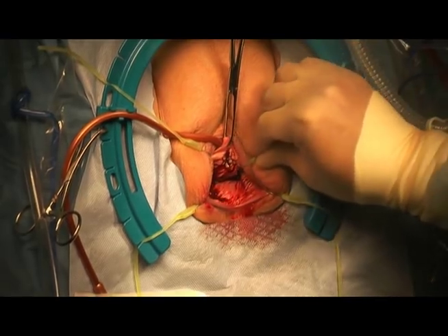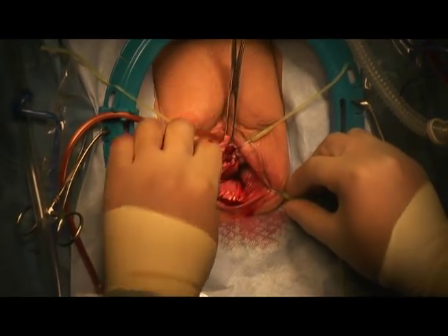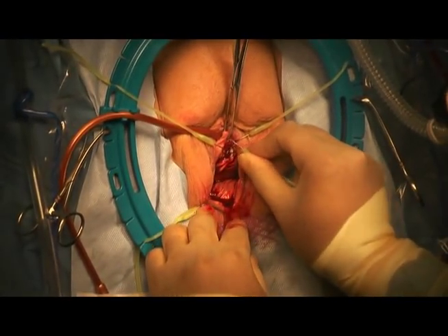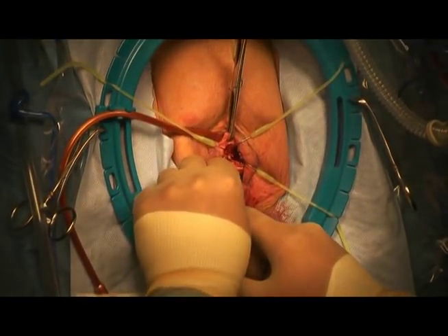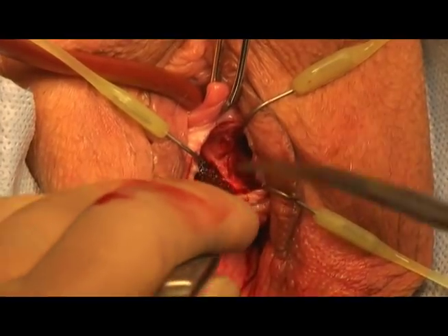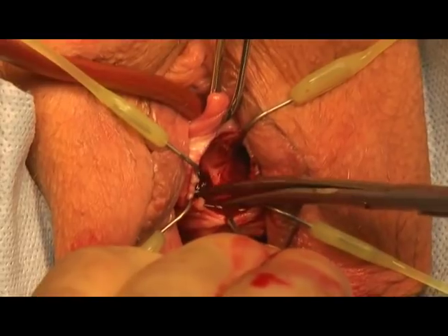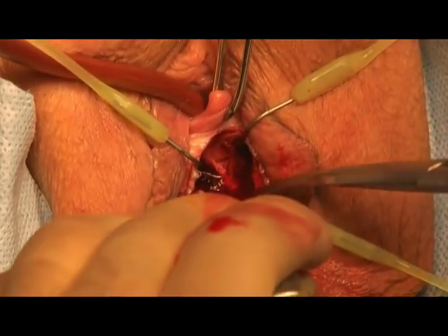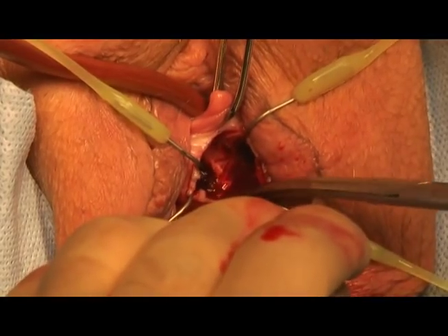Since I don't have an assistant I want to use my Lone Star Retractor to give me as much efficiency as possible. You can see here I'm using the yellow hooks to pull the edges back so I can see where my mid-urethra is when I put my sling. In this clip you'll see me developing the mid-urethra just a bit more. I do this so that my sling or mesh lays quite flat and is not folded over — I try to get this area as flat as possible.